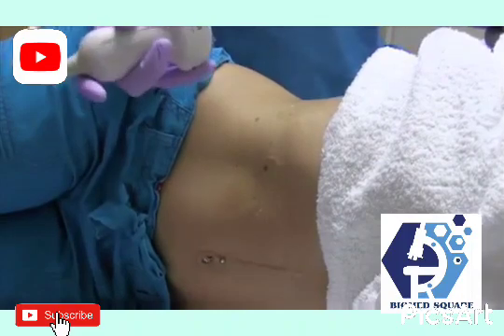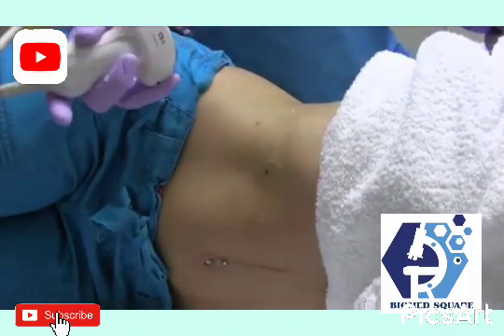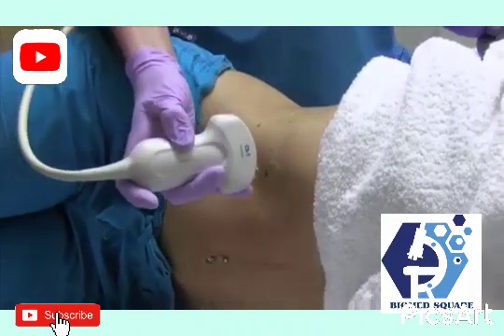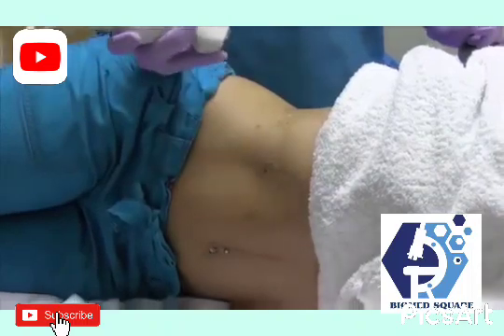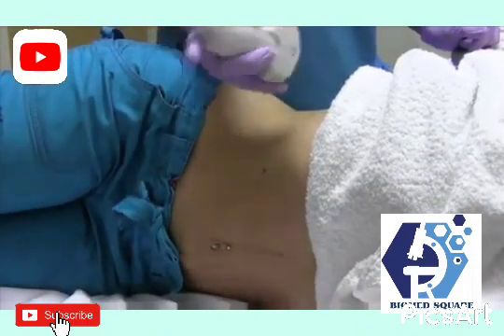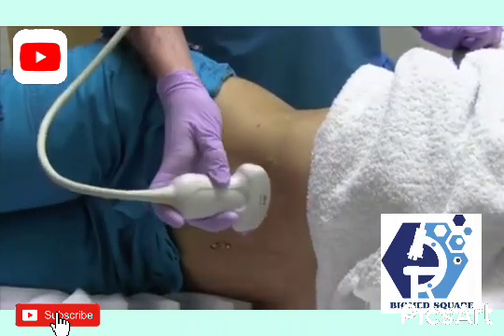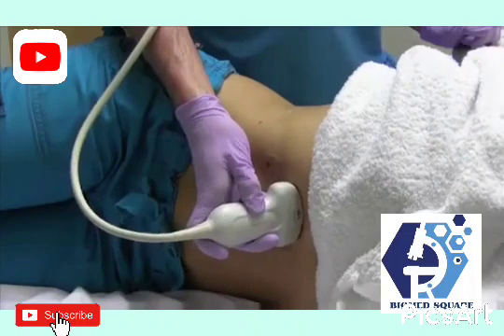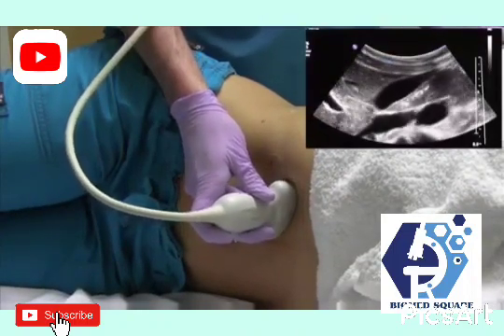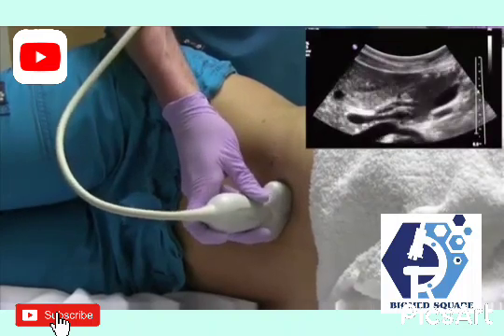So after you get your supine pictures of the gallbladder, you want to make sure you decube the patient just to make sure there are no stones that are stuck in the neck of the gallbladder. You have the patient turn on their left side away from you, and that usually brings the gallbladder forward here. So we're going to come subcostal here and just sweep through, and you should see the gallbladder very anterior here.